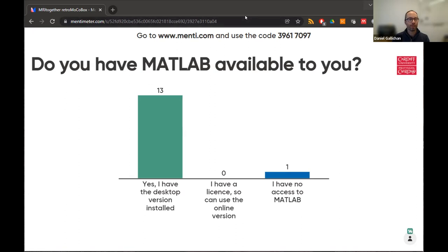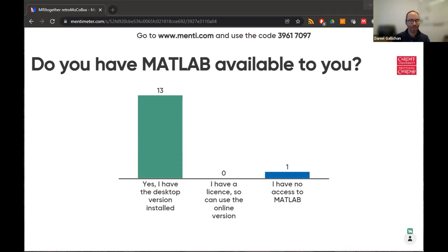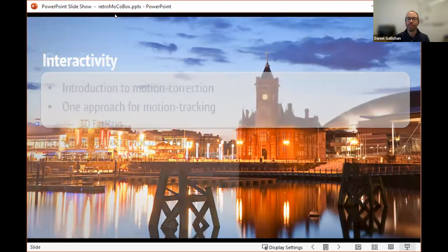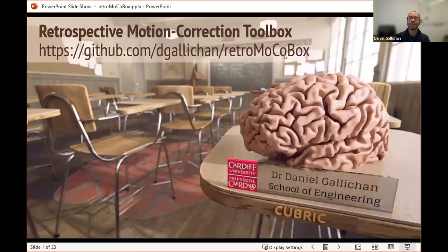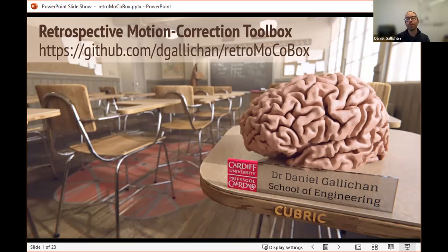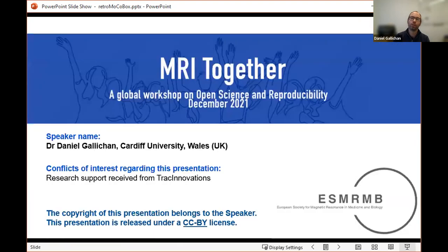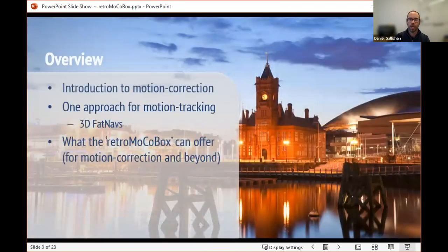If you are a GitHub person, you might want to already go to — if you Google RetroMoCoBox, that's the name of the software. Just download it and put it on your path — it adds itself to your path. There are three demo scripts, and you could do the downloading bit already if you want to get ahead of ourselves.